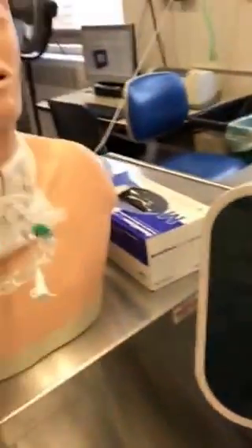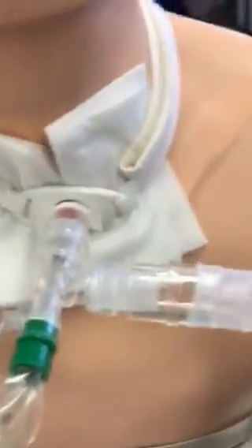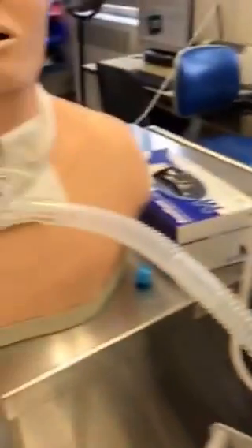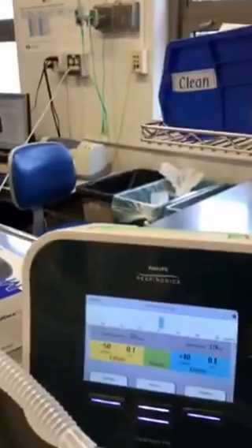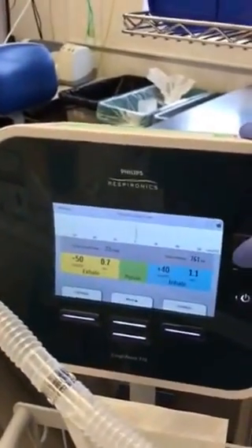So like I said, you're gonna hyperoxygenate your patient or have an O2 bleed in. Then you're gonna hit your ventilator and hit standby, pop your top off, and hook it up to the patient right here. Sorry for all the shaking. You're gonna hook it up, give them a couple breaths, make sure you see chest rise, and then you're gonna start it up.